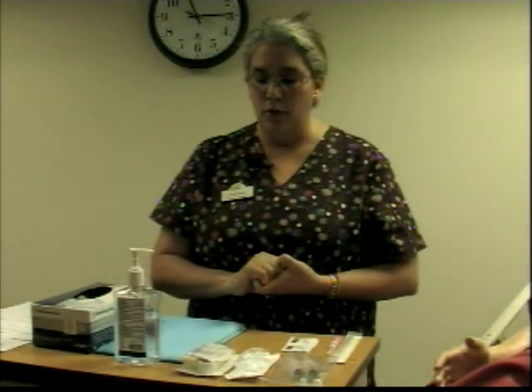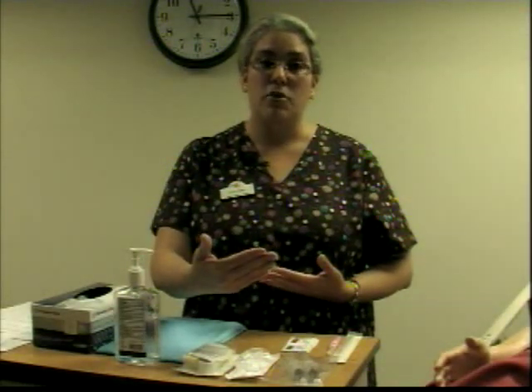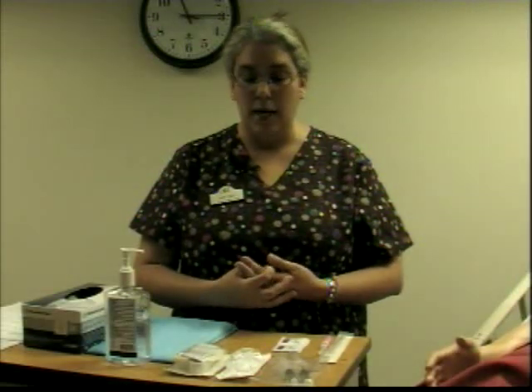Another thing that you have to pay attention to is the ability of the client to tolerate the procedure. A client that is confused or combative is going to fight you all the way through. So you want to foresee any issues and bring help with you, not to restrain the client, but just to keep him busy while you perform the skill, so you are able to minimize the risk of needle stick for you and whoever is helping you.